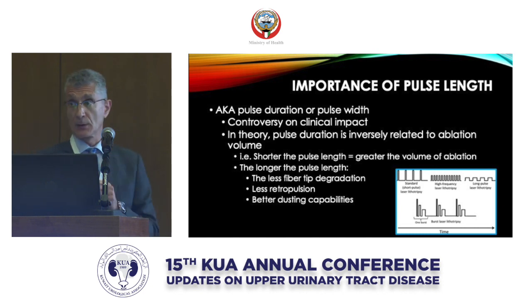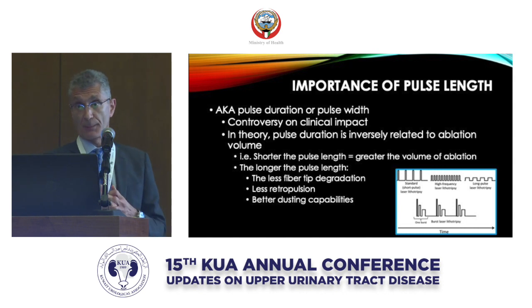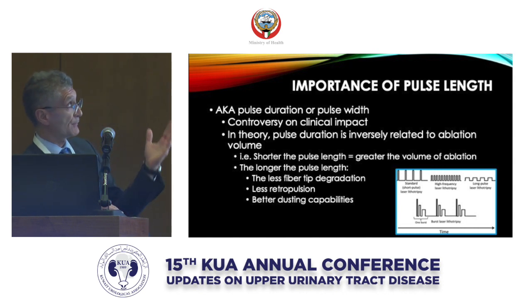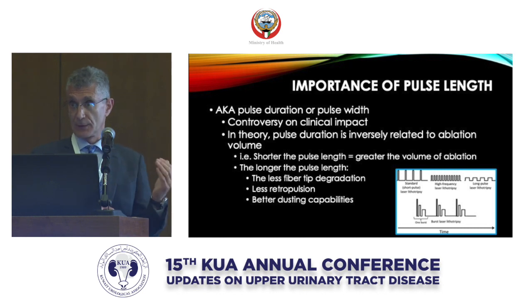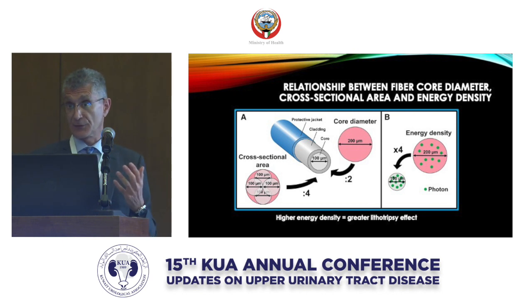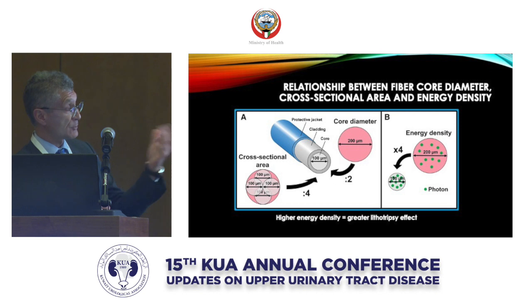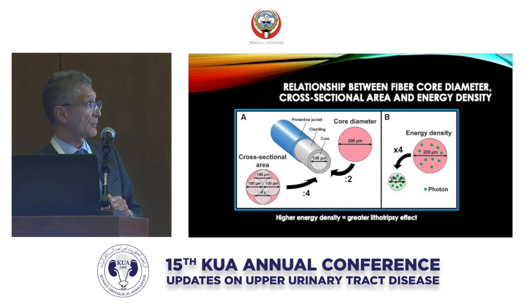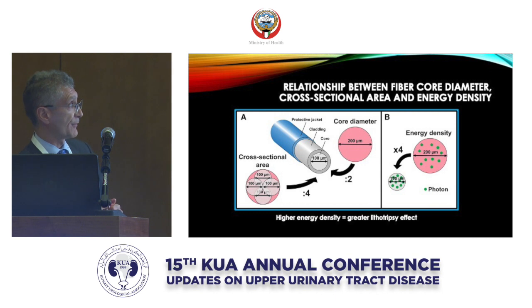what it has also shown now, something that we're seeing clinically, which maybe hadn't been assessed properly in a preclinical fashion, is the different stone compositions and how the thulium fiber laser works for the various types of stones. And one of the observations I've had is that calcium phosphate, pure calcium phosphate stones don't seem to break as well or as efficiently. And interestingly, in this in vitro study, which was from Dr. Traxler's group, the red starred stone compositions, calcium oxalate monohydrate and carbonate apatite, pure calcium phosphate stones.